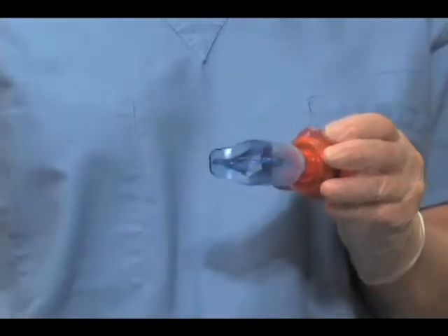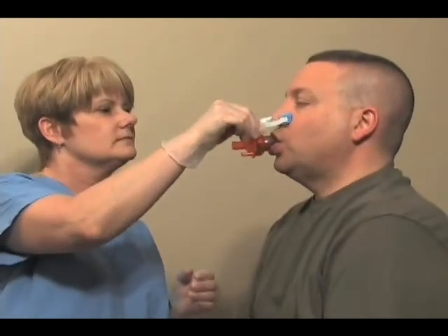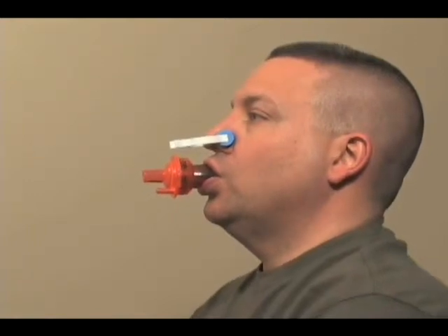Simply connect the patient port to the mouthpiece. Have the patient place the mouthpiece in their mouth, maintaining a tight seal with their lips. A nose clip is provided to prevent the patient from breathing in through their nose and bypassing the therapy. Like the face mask, the patient should be instructed that it will be slightly harder to breathe through the ResQguard, and that they should breathe normally at a rate of 10 to 16 times per minute and slowly over 2 to 3 seconds per breath.